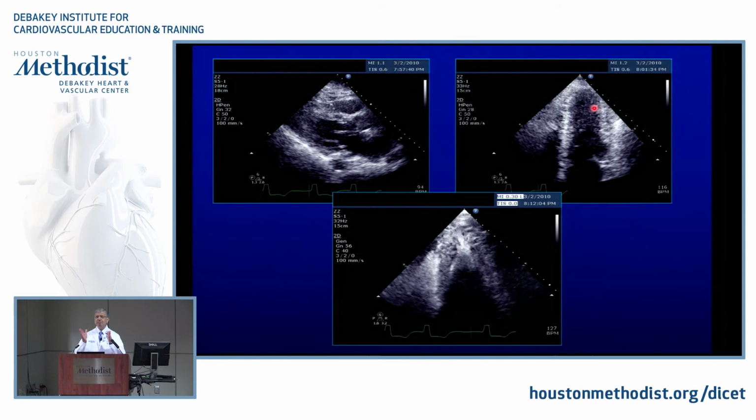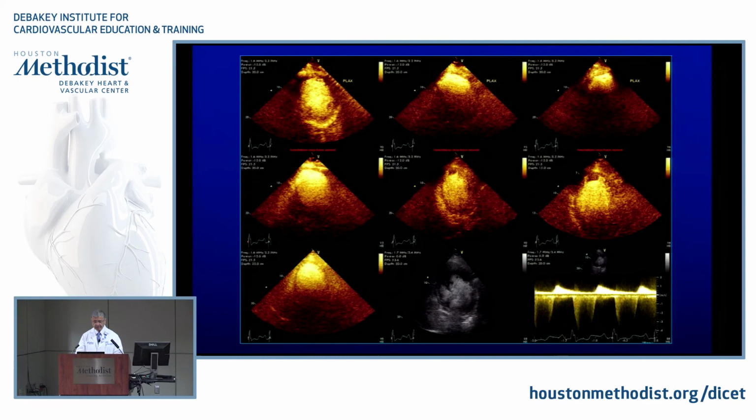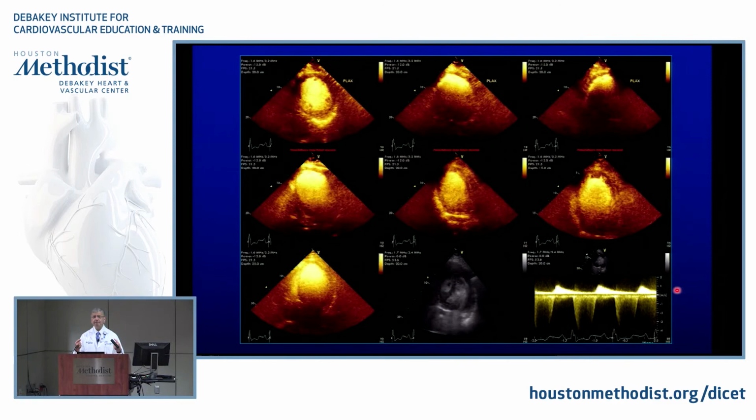You don't have much space for the heart to move, just about 3 millimeters, and you're not going to be able to move that from the epicardium. So usually it kind of stays as a cap, and you have some thickening inside, and that's what you see. And look at these very prominent perforators, that are not only the septal perforators, but the arteries become so large that you can actually image them emptying into the heart. Okay, now I want you to tell me two of the phenomena that we talked about today in this collage.